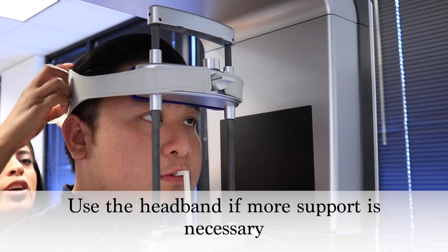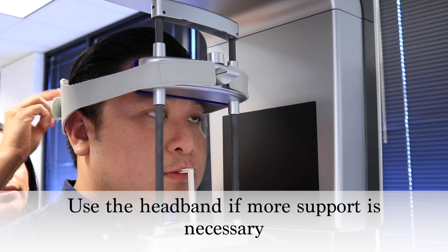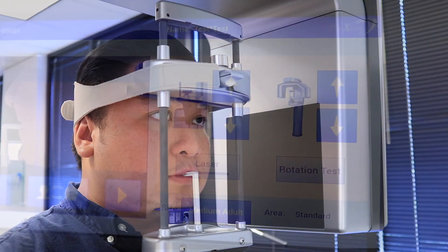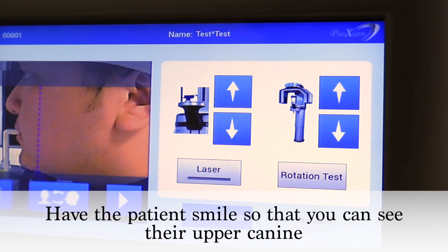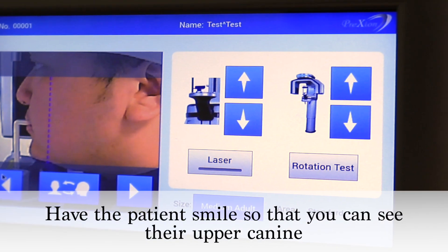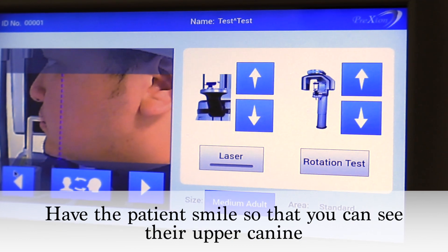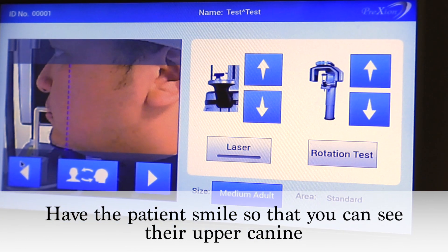Use the headband to secure the patient's head. Looking at the highlighted fields of view box, the blue vertical dotted line is the focal point of the panoramic image and needs to be positioned distal to the canine.